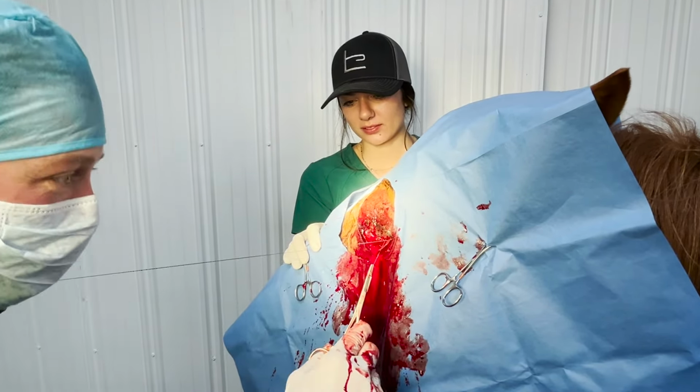Then all we're going to do is put gauze over the eye, and then use a little bit of cast padding for a little more protection, then wrap it with some elastic adhesive bandage. So she'll look like a pirate for a few days. We'll change it tomorrow. This part's probably harder than the surgery itself. You got to get it snug enough where it'll stay, but not too tight where she can't eat or get back on her throat, because this bandage will stay on for a few days.